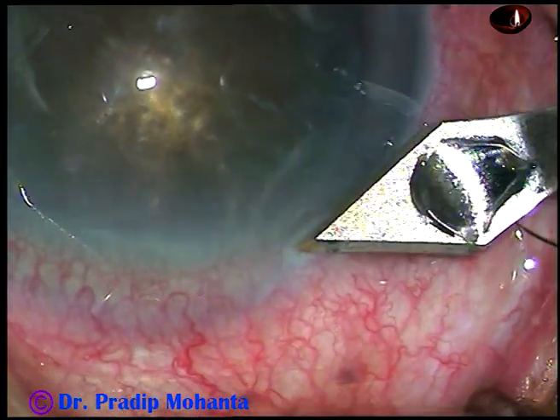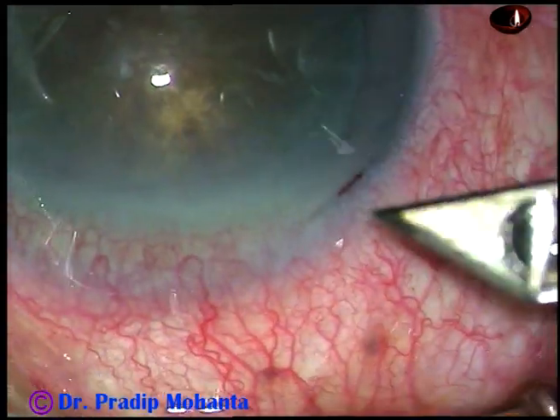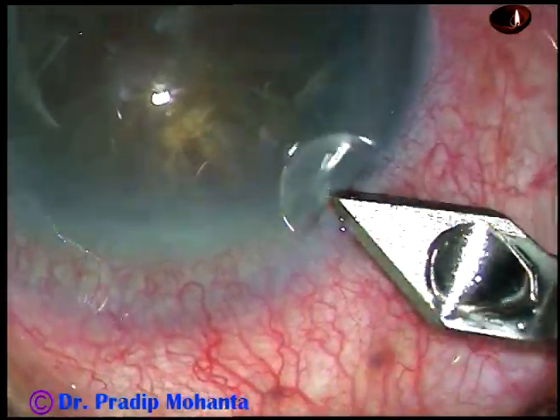Dear colleagues, this is a very hard cataract. Let us observe the surgical steps.